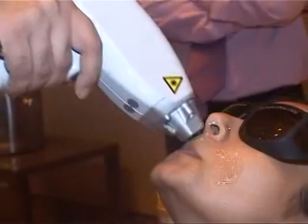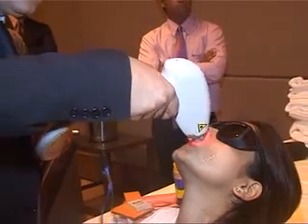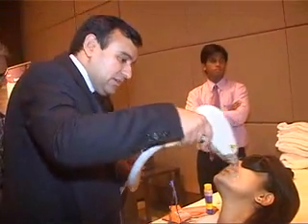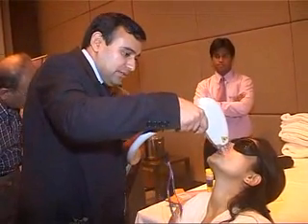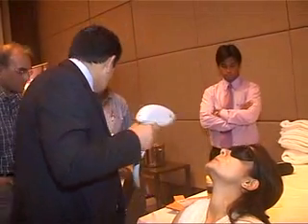How many passes have you delivered? Passes are not very important. What is the total energy that is required? The joules that you deliver is the end point. When you deliver 3 kJ in this area, that's the end point. The machine is counting for us — we have already preset that.